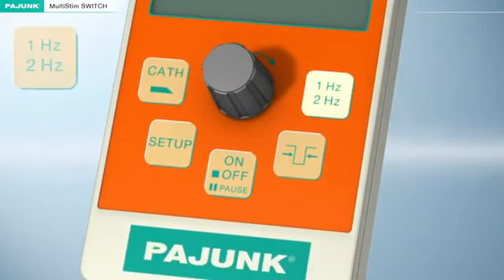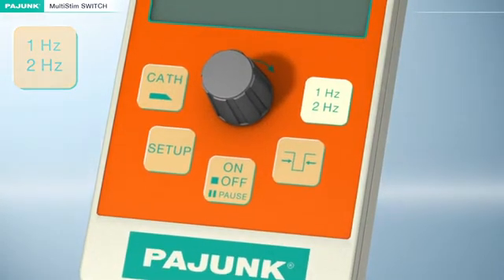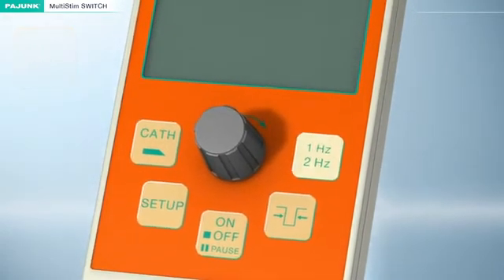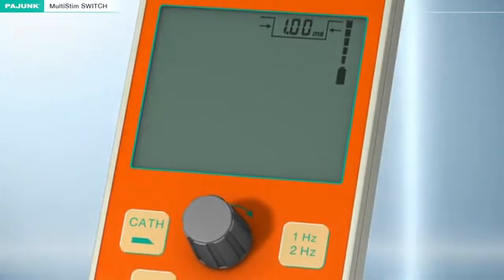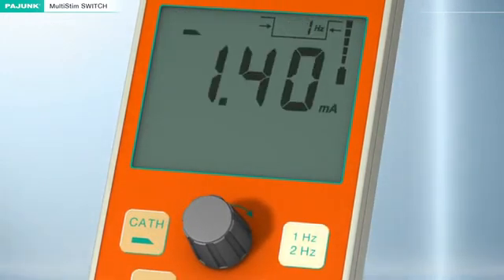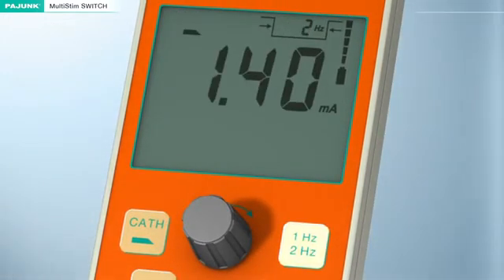Pulse Repetition Frequency: The desired pulse repetition frequency can be selected with this button — either 1 Hz or 2 Hz.